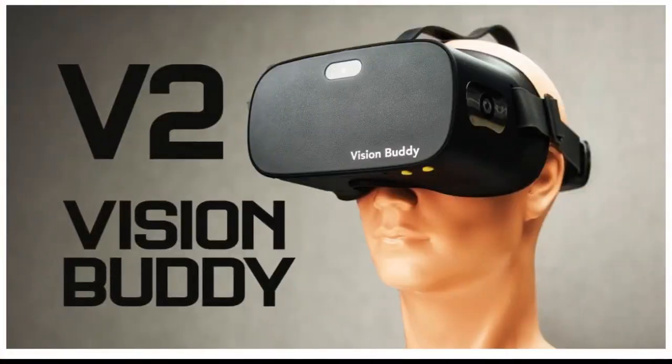So that was the previous version. The new version works basically the same — they've just updated things a little bit. For the live magnification mode, we are using the camera in the front of the Vision Buddy here, and that is a 16 megapixel camera. Previously they weren't able to take full advantage of that camera, but with the new headset — which is actually black now instead of white, for those of you who are fashion conscious — they are able to take more advantage of the camera, so you've got an improved image and it's better quality.